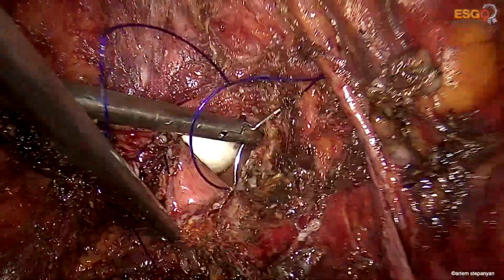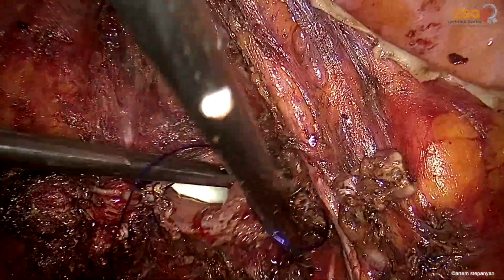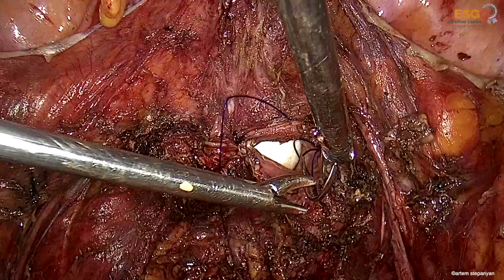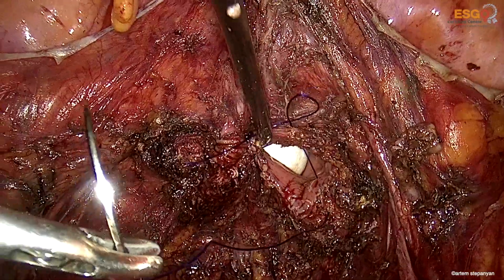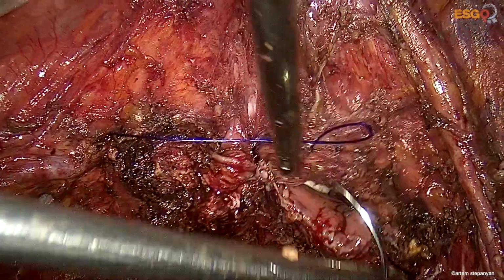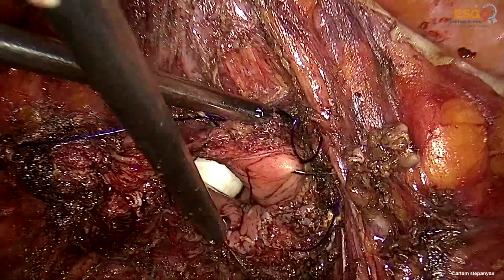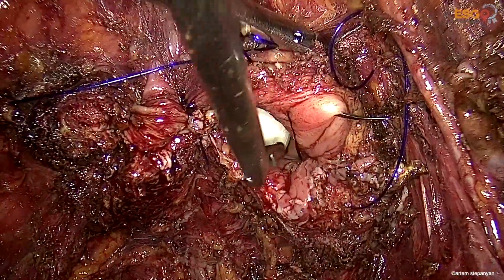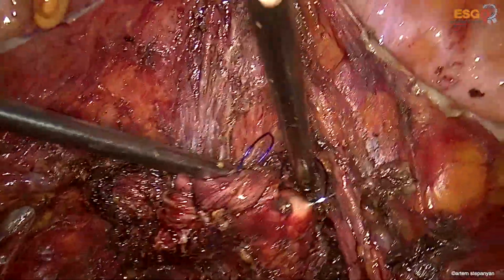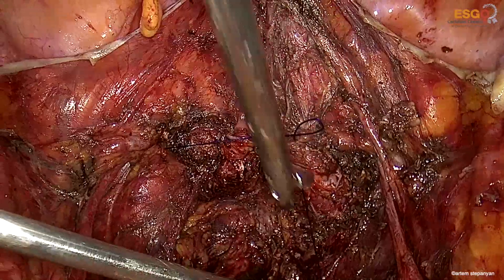Now we catch the posterior wall with the stump of the uterosacral, and then we catch the anterior wall incorporating the pubocervical fascia, and the last bite to the posterior wall incorporating the Denonvilliers' fascia.